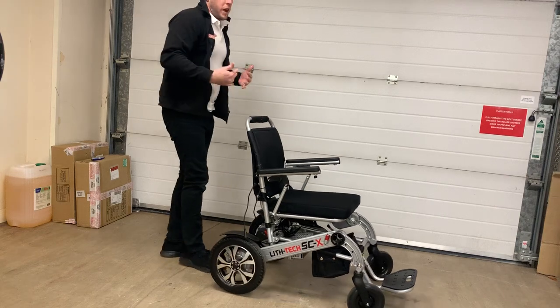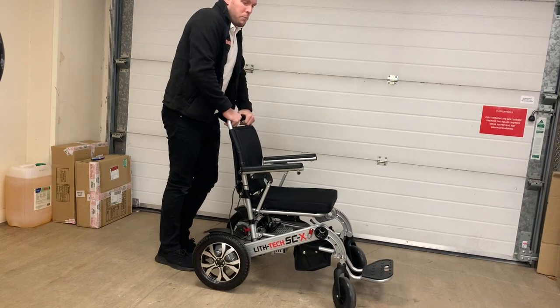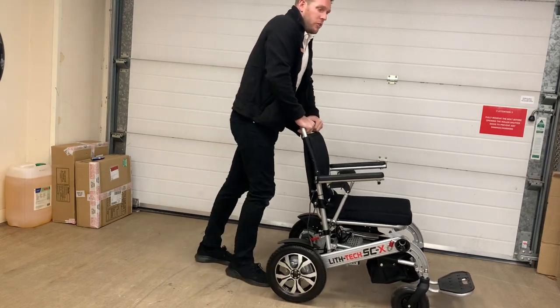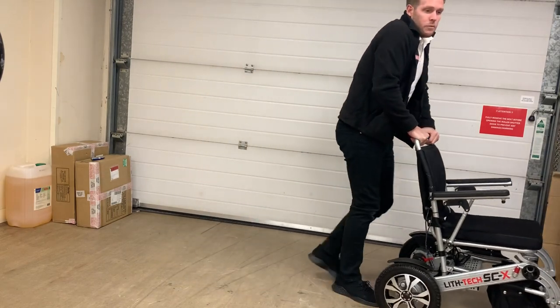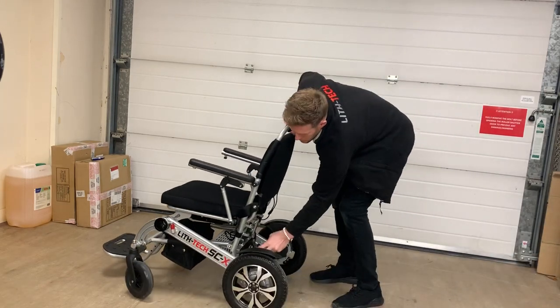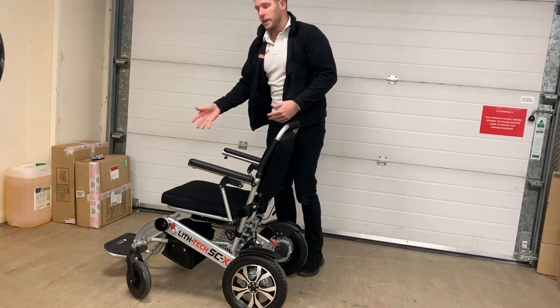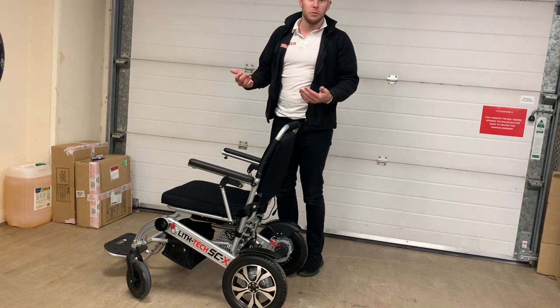It also means this chair could be operated a bit like a stroller. A lot of our customers still want to have some exercise and mobility but also get tired quite easily. So they could use this chair as a stroller, and then the minute they get tired they can flip the motors back to electric mode — when the joystick's in they can sit down and operate it as an electric chair.